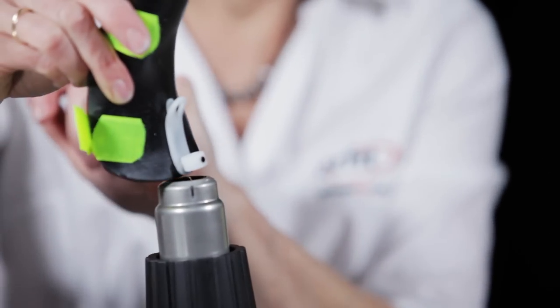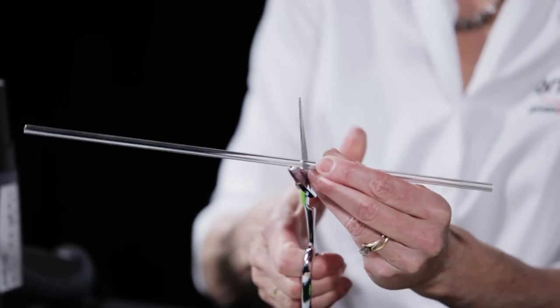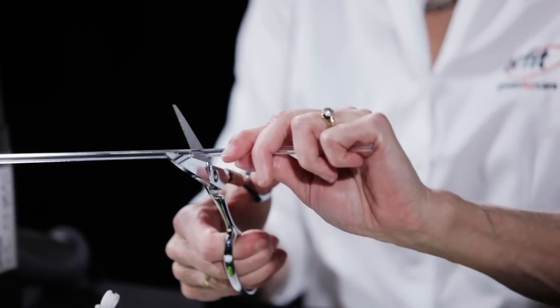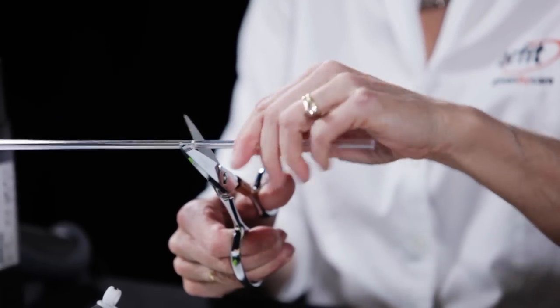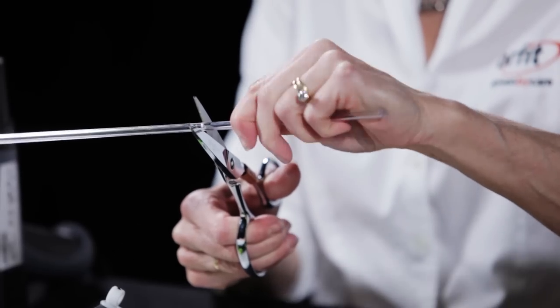The Orfitube can be shortened to the appropriate length by scoring with scissors and breaking cleanly at the mark. Bending the Orfitube does not require heating.